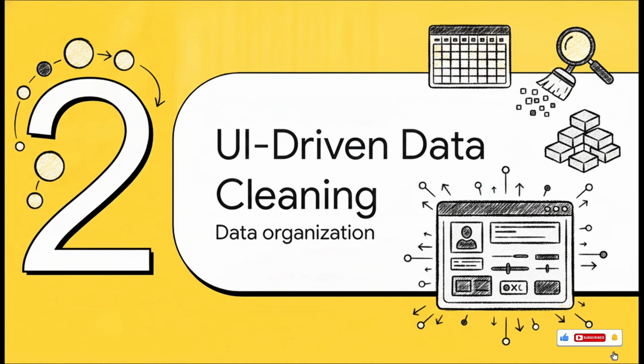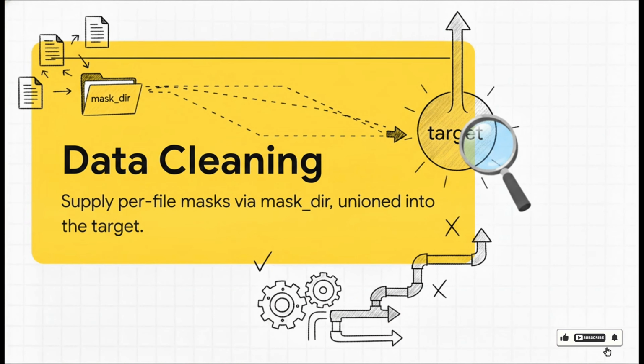Moving right along to Section 2, UI-driven data cleaning. Now, as any practitioner will tell you, generating all that complex, upsampled data is really only half the battle. You also have to make sure the data you're feeding into your models is pristine, organized, and actually usable. The source brilliantly illustrates the workflow they've built to handle exactly that. Through their user interface, you can meticulously manage your data hygiene. You do this by supplying per-file masks via a specific directory called the mask_dir.